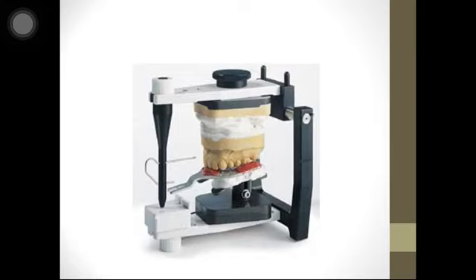Then how the mandibular arch is joined with the maxillary arch is very simple. It is recorded with the help of horizontal jaw relation, and then the mandibular cast is easily joined to the lower member of the articulator with the help of maxillomandibular records.